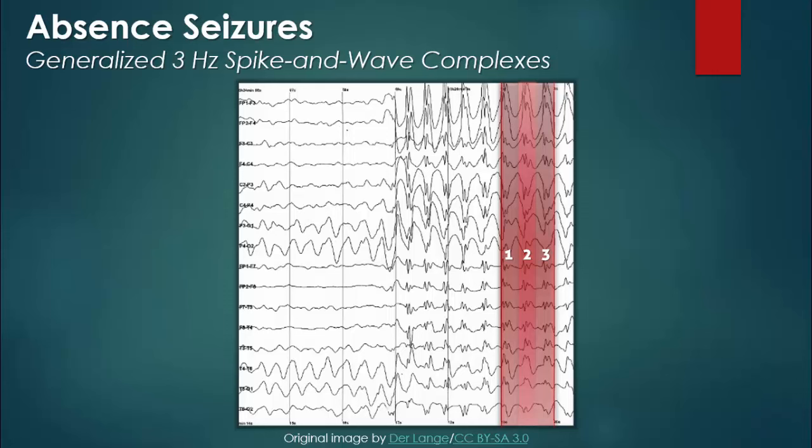The frequency of these complexes, however, is variable and not necessarily consistent from start to finish. They often begin with a higher frequency and slow down a little before abruptly ending.